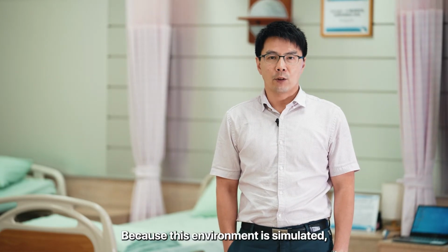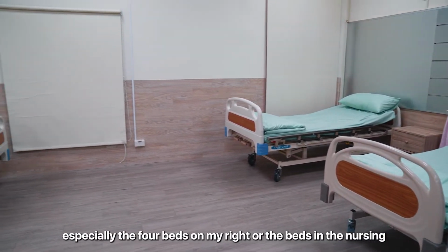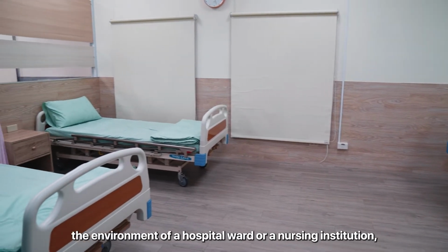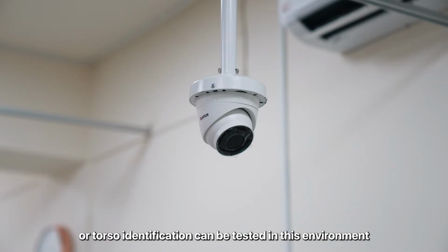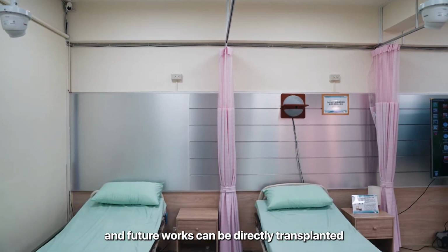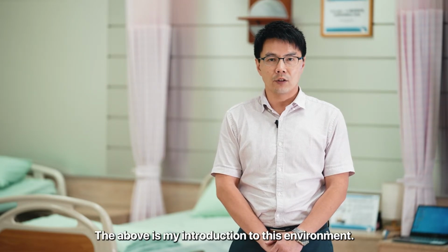Because this environment is simulated, especially the 4 beds on my right or the beds in the nursing institution are built to completely simulate the environment of a hospital ward or a nursing institution. So some works related to physical fitness or torso identification can be tested in this environment and verified in the field, and future works can be directly transplanted into the environment of hospitals or institutions. The above is my introduction to this environment.